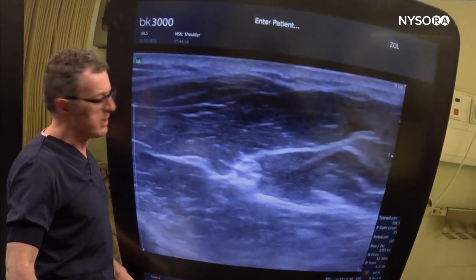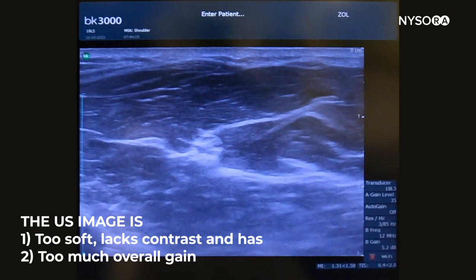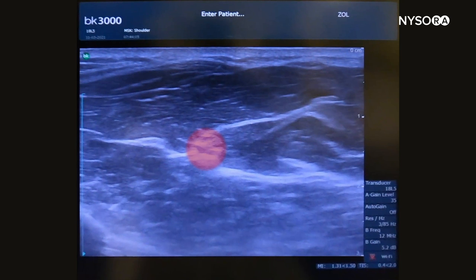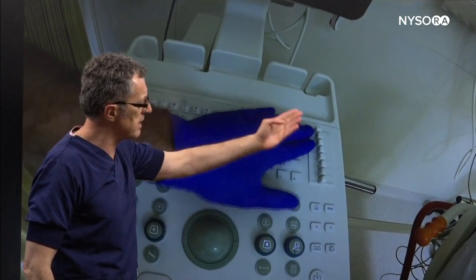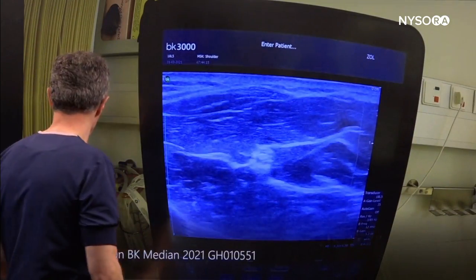Here's the image that we have right now without any adjustments, and to my perception this image is a bit too bright — too bright at the top and too bright on the bottom. I don't have great contrast of the median nerve, particularly not of the fascial sheets that we are interested in when performing a median nerve block. So we're going to bring the time gain compensation back to neutral, and here's the resulting image.